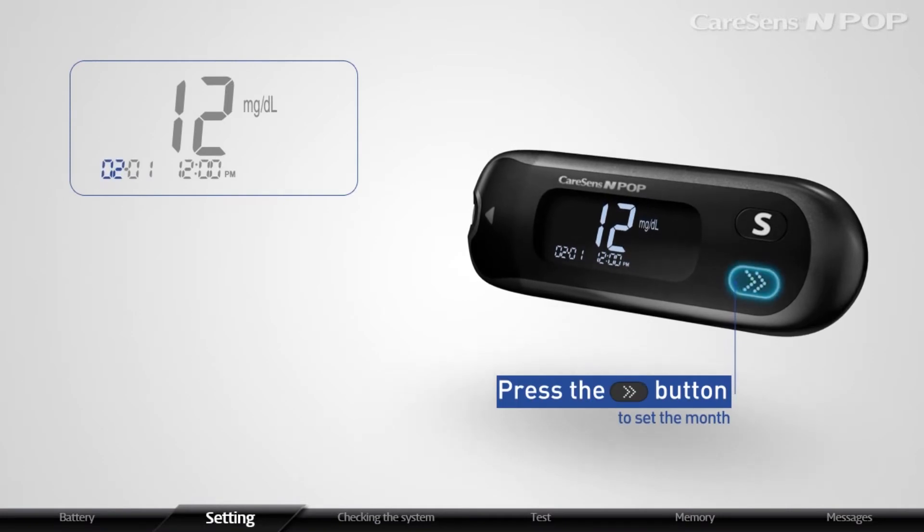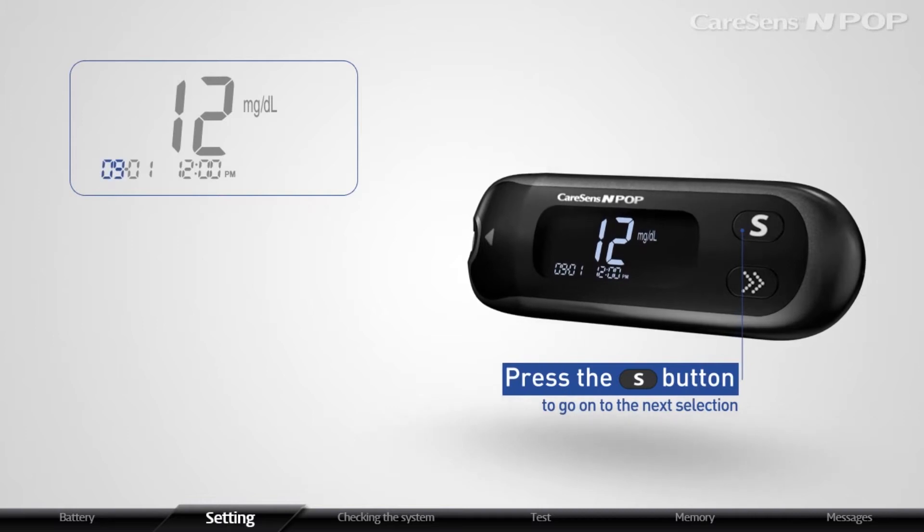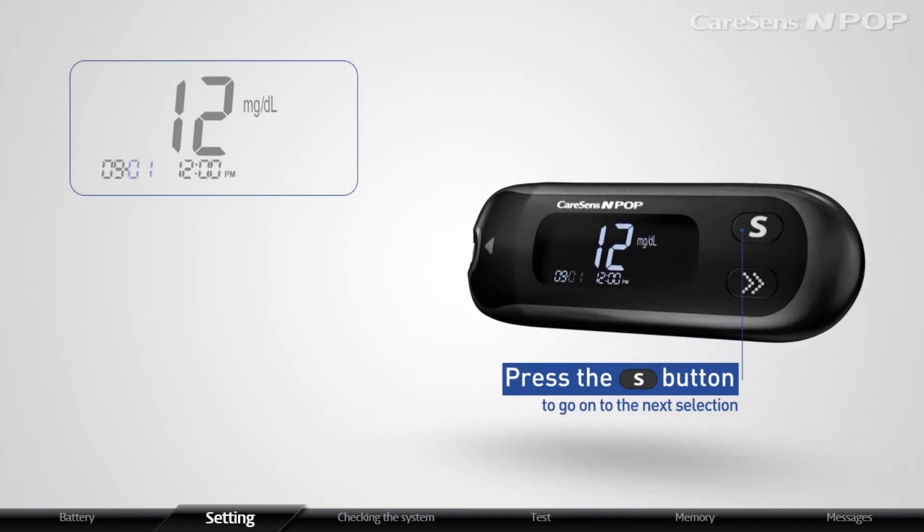When the number indicating the month blinks, press the arrow button to set the month. When the month is properly set, press the S button to go on to the next selection.